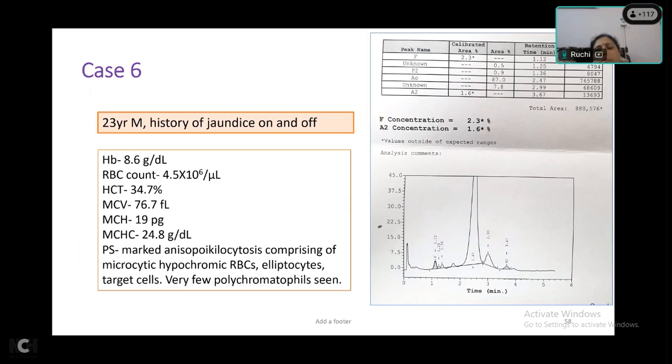Okay. Anything else in the graph? Just the initial part of the graph. Look carefully. There is a peak in the pre-integration. ओके, बट अगर जॉन्डिस होता है तो बिलिरुबिन की वजह से भी ये पीक आता है, तो वो कई बार it is there because of bilirubin also. Anything else? Anybody? Any volunteers?